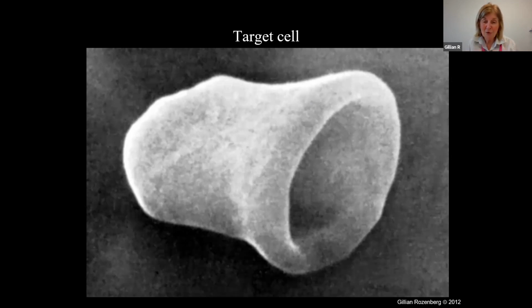And you may have a film where you've got moderate target cells with an MCV perhaps of 56, keeping in mind the range is 80 to 100. So 56 femtoliters, you'd expect to see lots of microcytes. But if you've got lots of moderate to marked target cells, that is the reason for that low MCV, not because there are microcytes there. Very important to remember that.